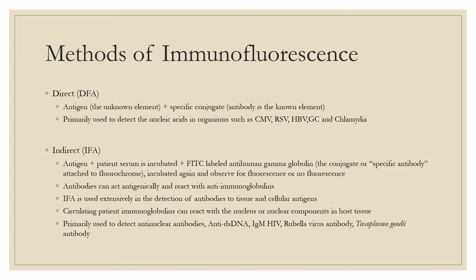In indirect immunofluorescent assays, the basis is that antibodies or immunoglobulins not only react with homologous antigens, but can also act as antigens and react with anti-immunoglobulins. IFA is the serological method that can be used for the detection of diverse antibodies, primarily in research laboratories.